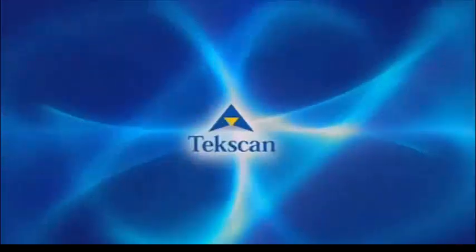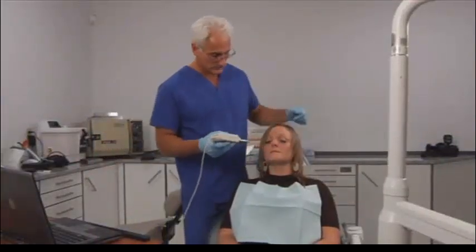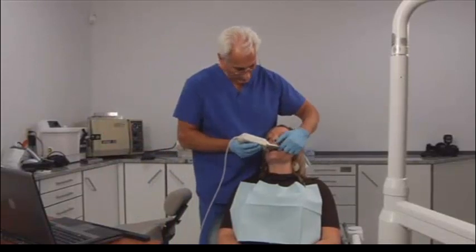So now that you've come back after a week, I'm going to remeasure you just as we did before to check your occlusion and your disclusion and do any subtle corrections to make it optimal. Okay. I'm going to have you bite down on the sensor again, but I just want to make sure that we have a good recording level for you again.